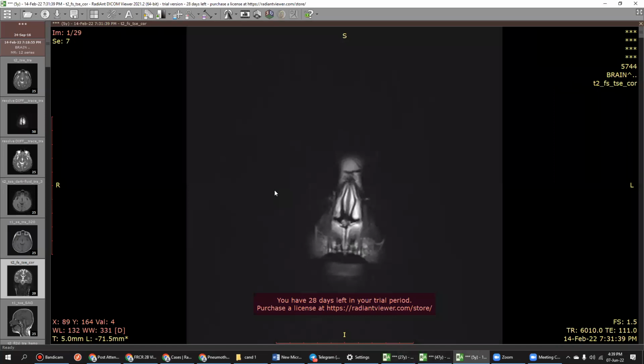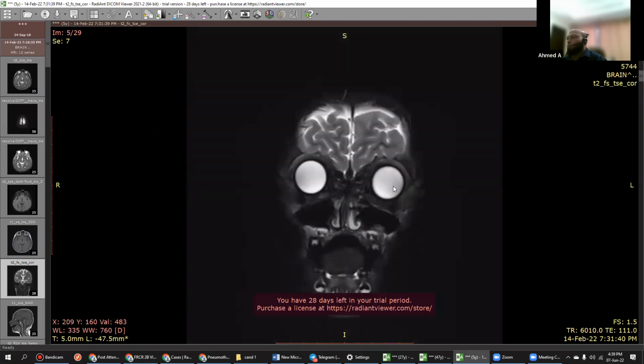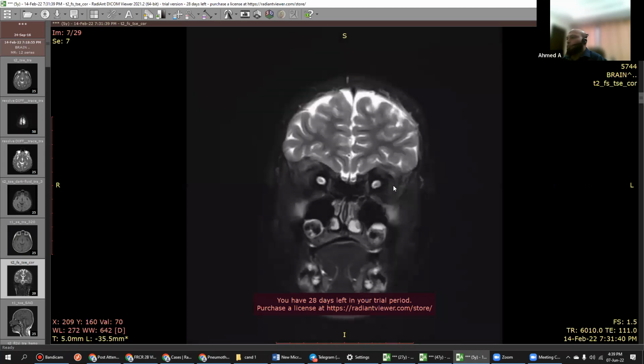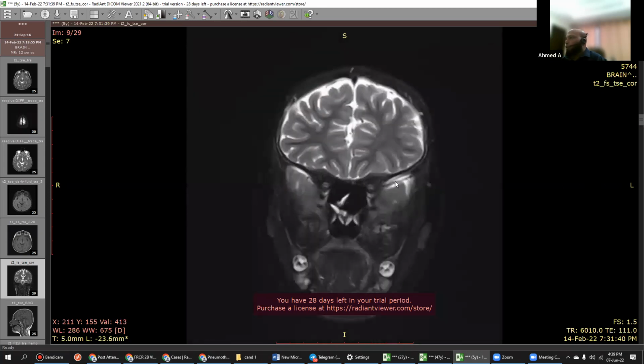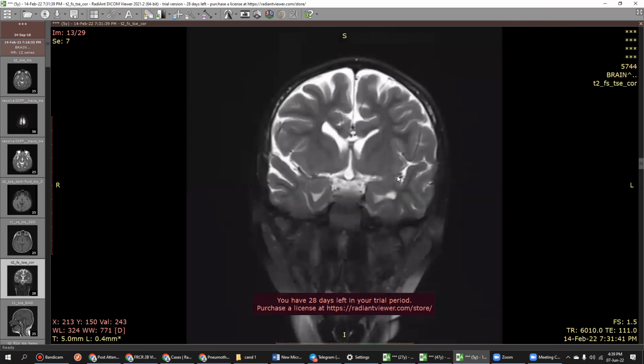Okay, you can scroll again. Sorry if I'm not helping you. Okay, I'm conducting more of a mock exam. Okay, yeah, okay.